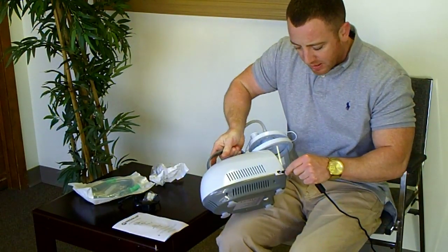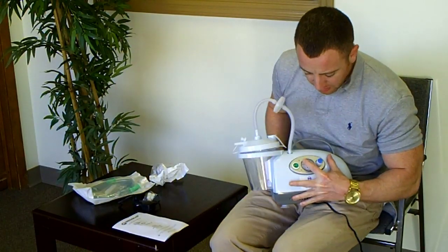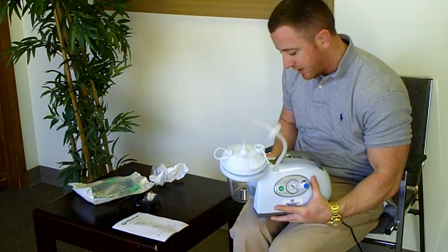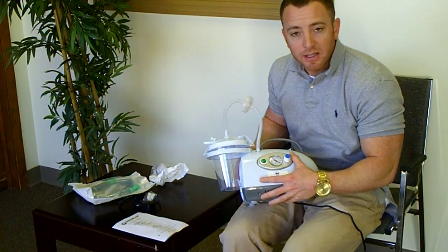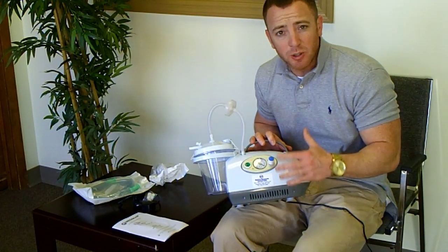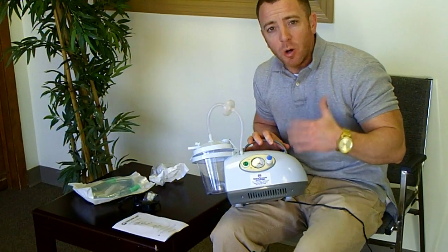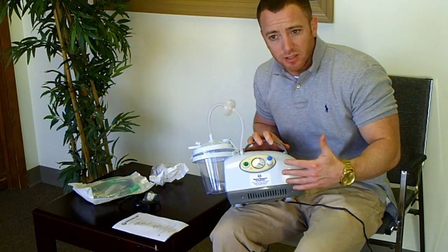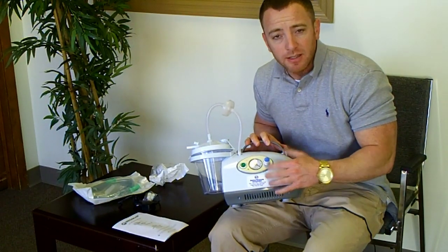Power cord goes in right here. And you can tell it's plugged in by these two lights here. And it's going to suck better when it's plugged in and charging. Your suction machine is also going to work better when it's brand new. So the older it gets, it's just not going to suck as good. And also if it's not plugged in and it has an internal battery, then it's not going to suck as good.